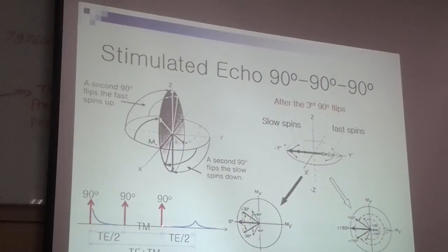After the dephasing of the spins during the time interval Tm, defined here, the other 90-degree RF pulse is applied. So after the third 90-degree RF pulse, the spins are focused like this, because these spins are also in the shape of an umbrella here.